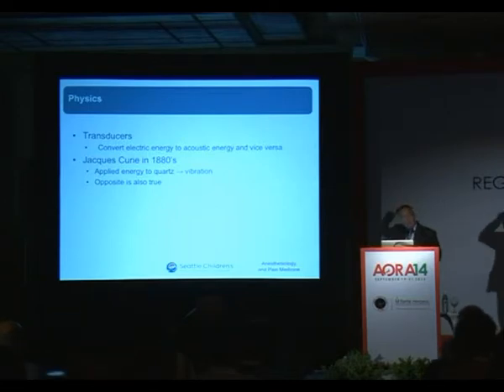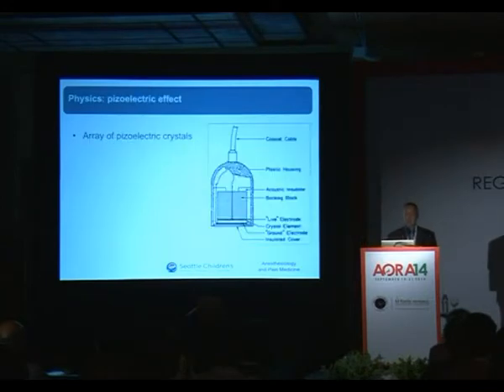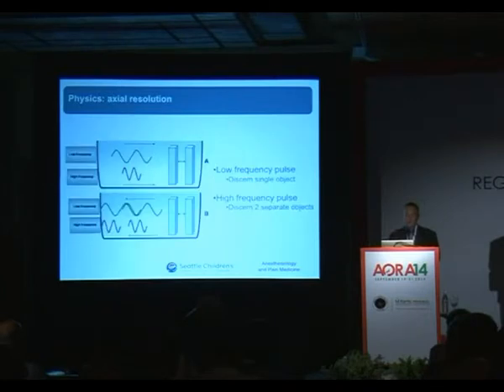It was Jacques Curie in the 1880s who first applied energy to quartz and demonstrated that this caused vibrations, and that the opposite is also true. Vibrations are converted by quartz crystals to energy. So the transducer probes that we use have an array of piezoelectric crystals, and they both emit and receive the ultrasound waves.